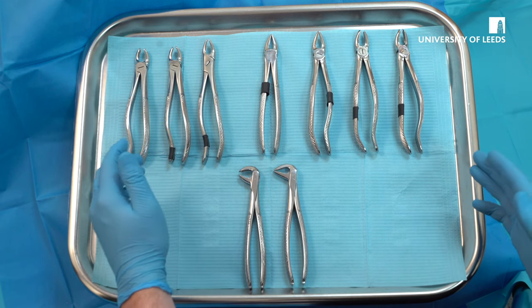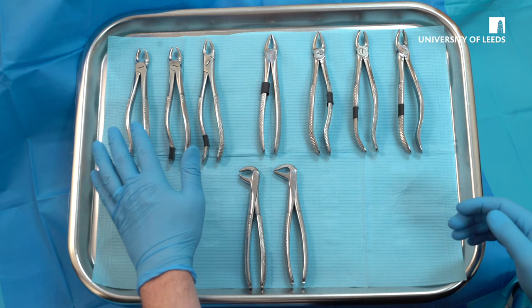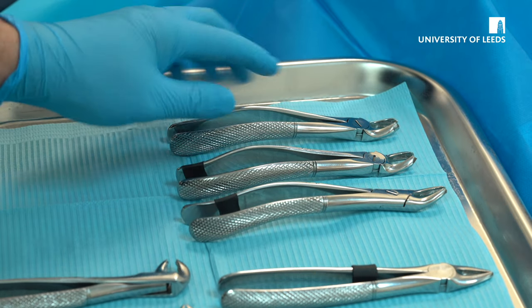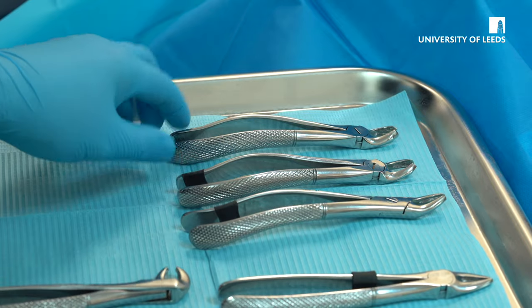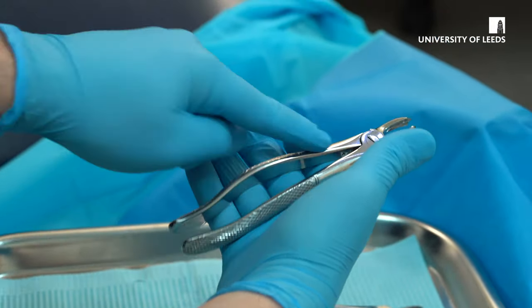Here we can see a selection of forceps for both right-handed and left-handed operators. Separate your forceps out and you will be able to identify that the forceps on the left-hand side are for a right-handed operator due to the curvature being where your fingers would be. For example, a right-handed operator would hold the forceps like so.